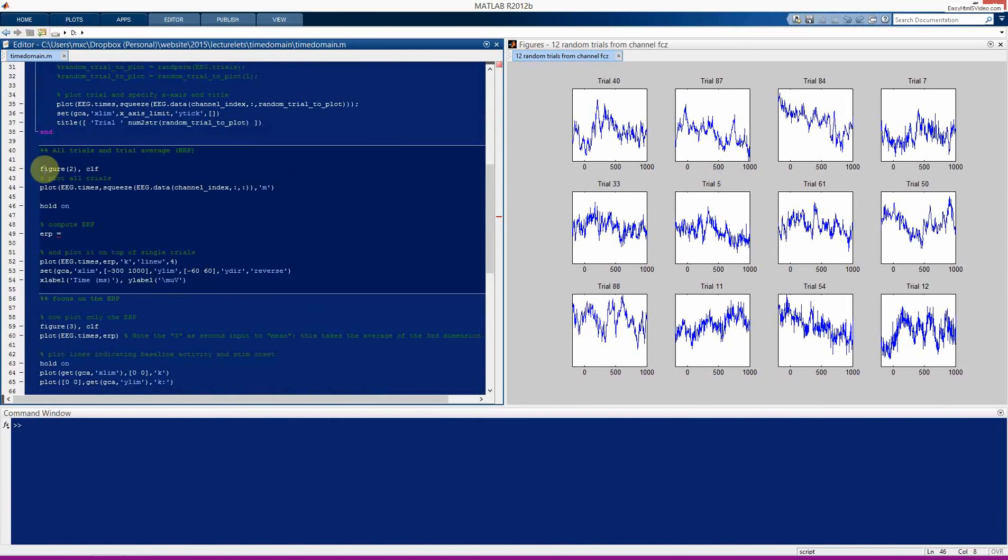So now in this cell starting on line 40, we are going to compute the ERP and then plot it. You can see here, we're going to plot the EEG.times vector by the ERP. And here on line 49 is where we will compute the ERP. So you can see that it's missing here. So I encourage you to pause the video or type very quickly and try and figure out how to create this ERP, how to finish this piece of code. And remember that the ERP is simply the mean or the average of the EEG data from this electrode over all of the trials.